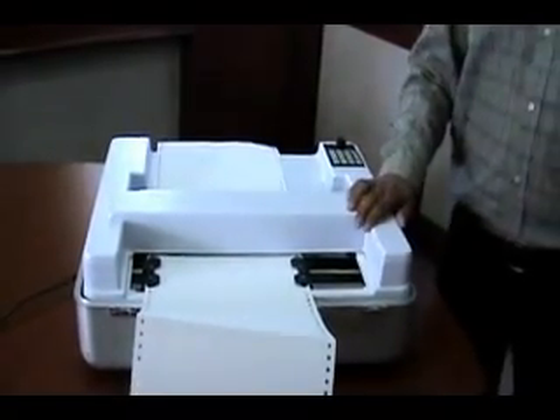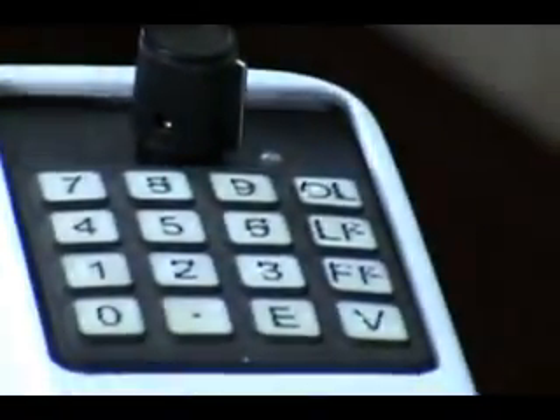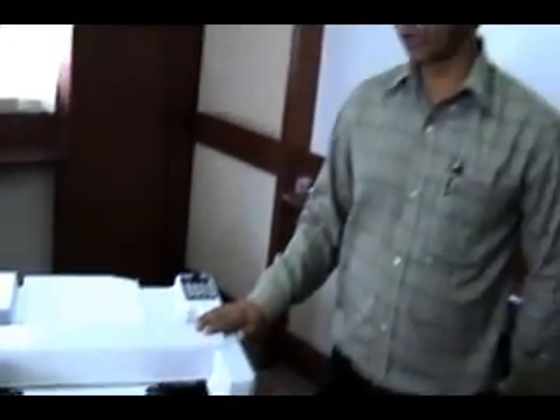You can send the document for printing with the help of Duxbury Braille software, which will print the document in Braille format. So now we will see how this embosser works by sending the document for printing.